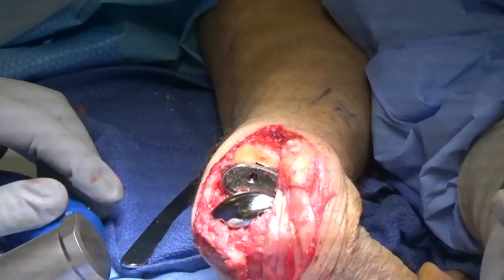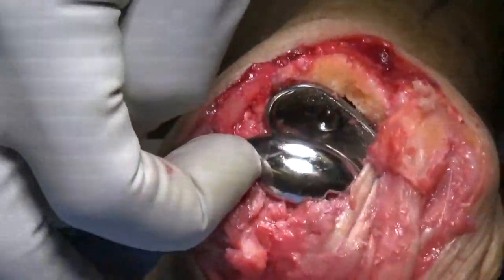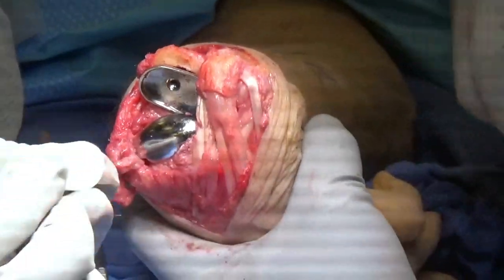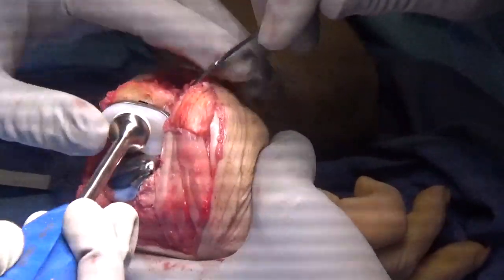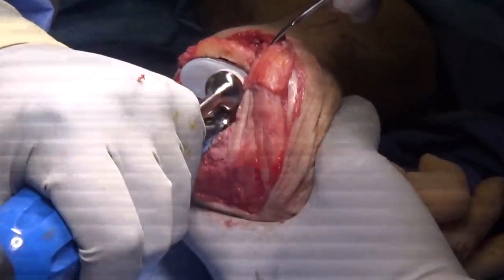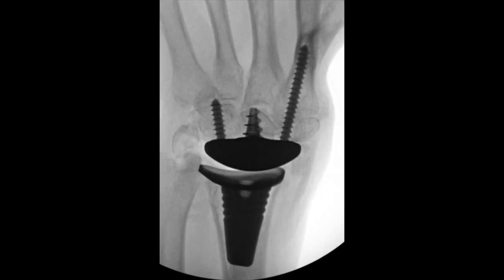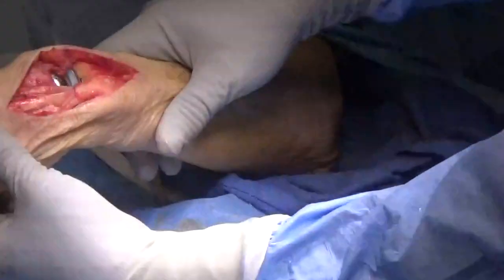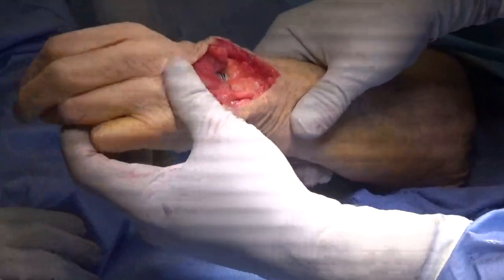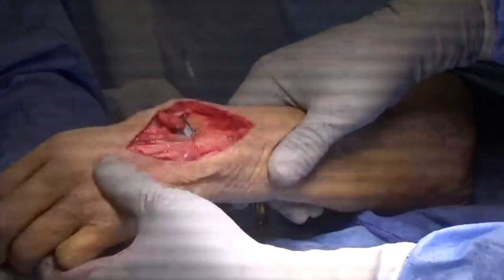The carpal articular component is then impacted into place, confirmed with the good Morse taper. And lastly, the poly component is being inserted onto our distal radius component. Fluoroscopic view shows excellent reduction. And clinically, a very good range of motion to the wrist, both with flexion extension and radial and ulnar deviation.